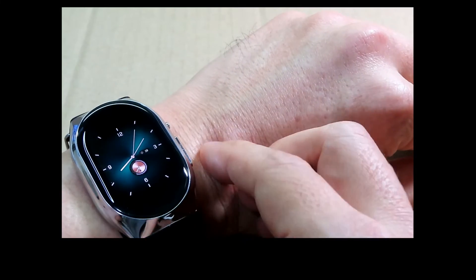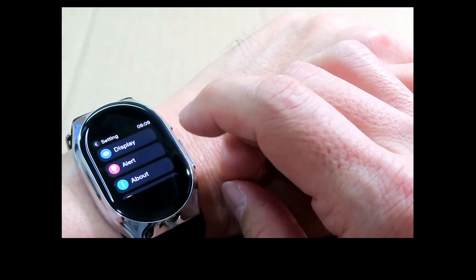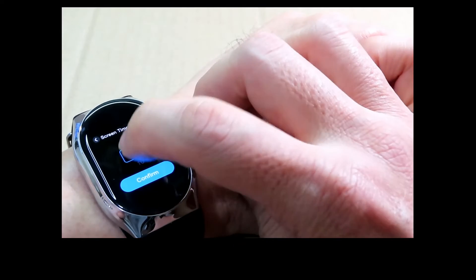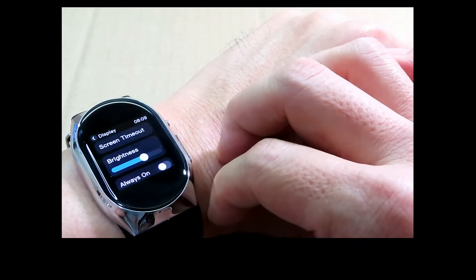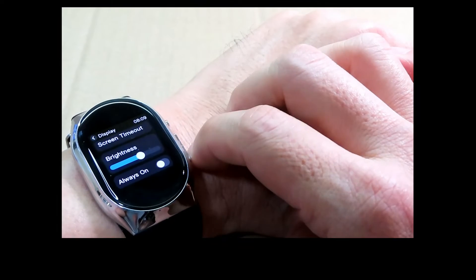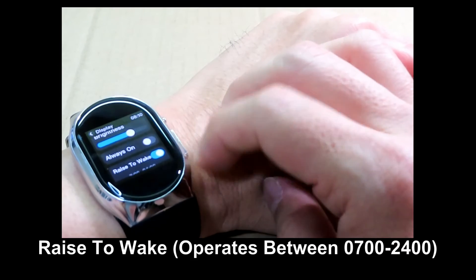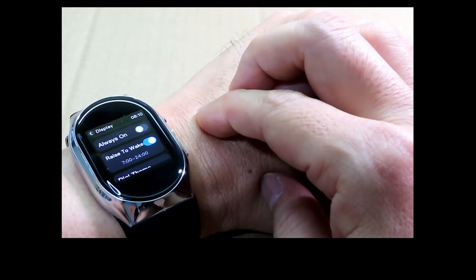You can press the power button to power it on and swipe to navigate. Let's go to settings, then display, and screen timeout. Five seconds is a little too short, so I'm going to change it to 15 seconds and confirm. You can change the brightness by playing with the slider, and you can turn it always on if needed. We'll tap on raise to wake, where each time you raise your hand between seven to midnight, it will turn on and display the time.